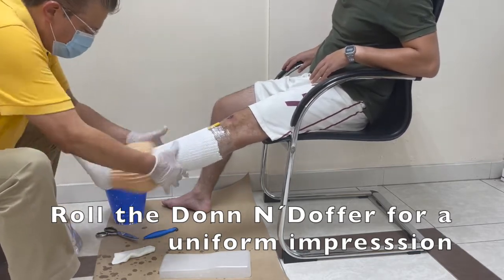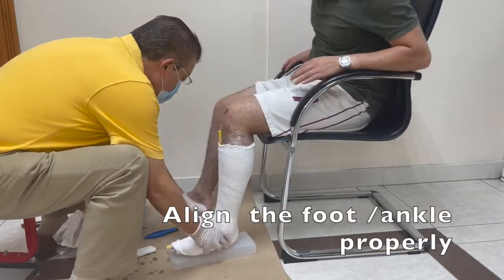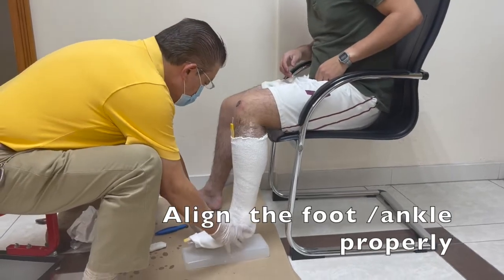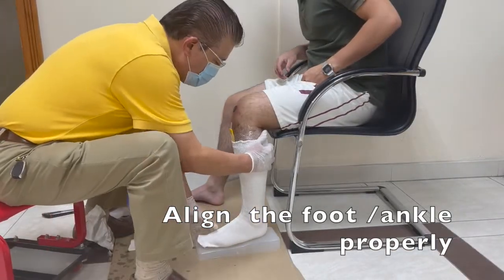It's easy — all you have to do is put the leg in and then align the foot and ankle properly, as we normally do when we cast an AFO.